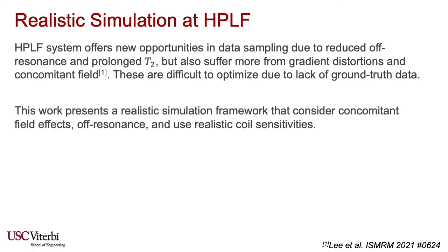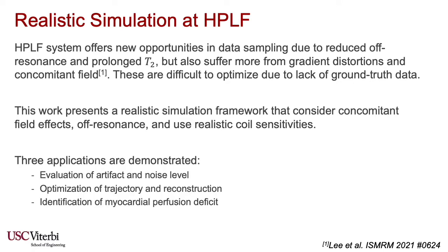To fill this gap, this work presents a realistic simulation framework that considers concomitant field effects, off-resonance, and uses realistic coil sensitivities. We also demonstrate 3 applications of the framework in evaluation of artifact and noise level, in optimization of trajectory and reconstruction, and in identification of myocardium perfusion deficit.